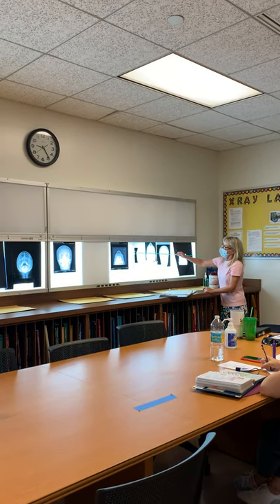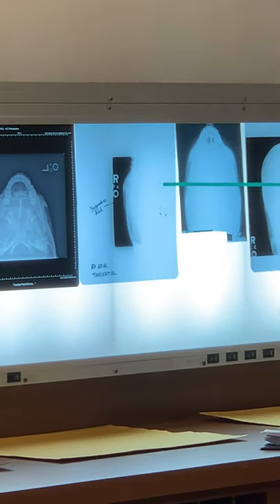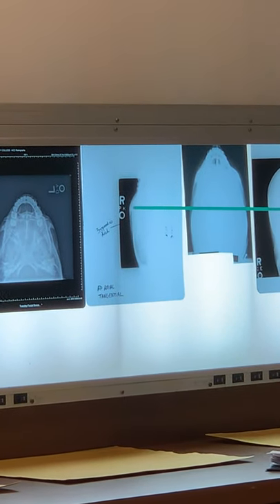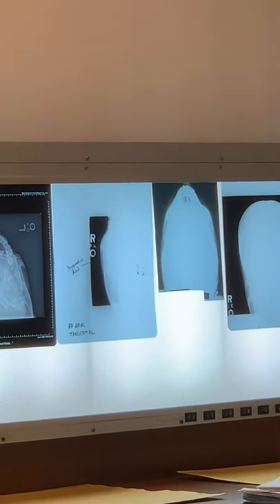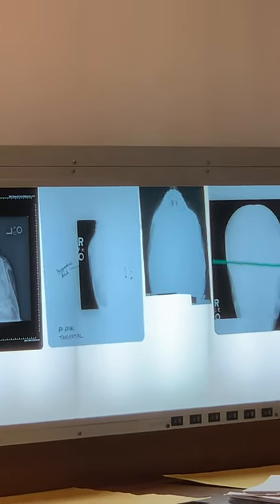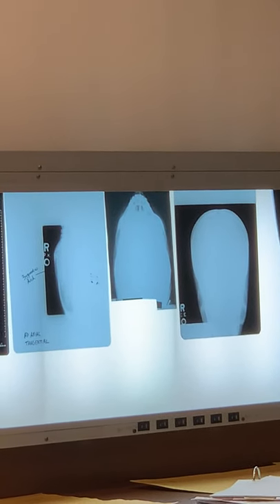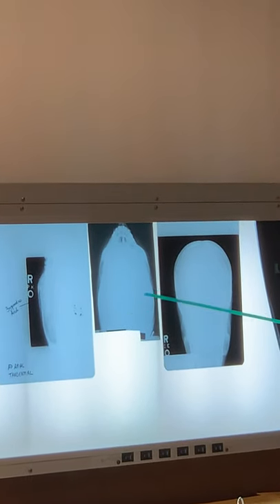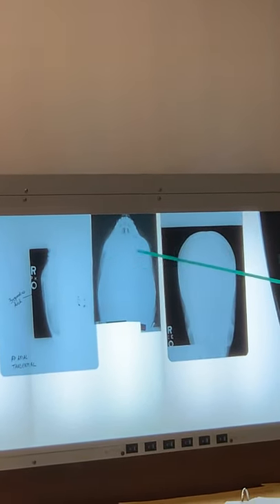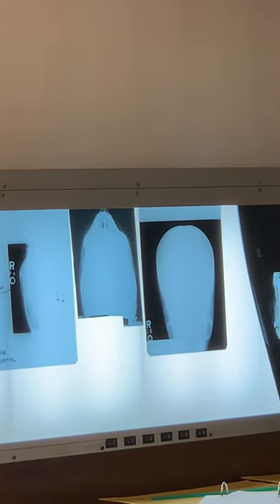So here's this one here. So they just rotated a little bit that way, 15 degrees that way. You still can't see it very well. So this one, here's the left side, here's the right. What would you go back and do? Turn it to the left just a little bit, because we see more of the right than we do the left. All right.